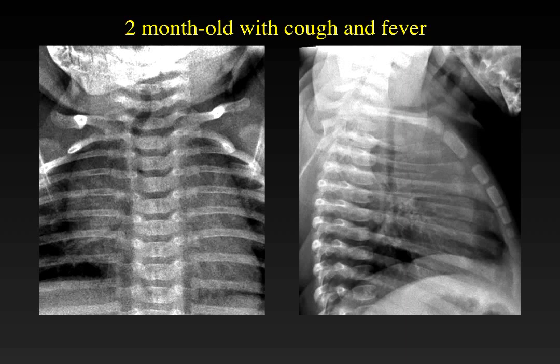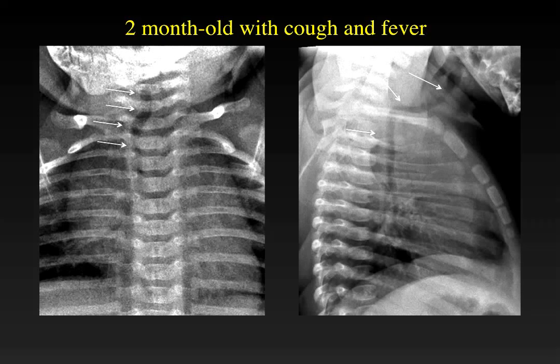What is very different in children compared to adults is that the trachea can markedly buckle during expiration. We can see that the trachea is buckled almost at 90 degrees on the frontal view, and markedly buckled on the lateral view. This is entirely normal and is much more strikingly seen the younger the child.